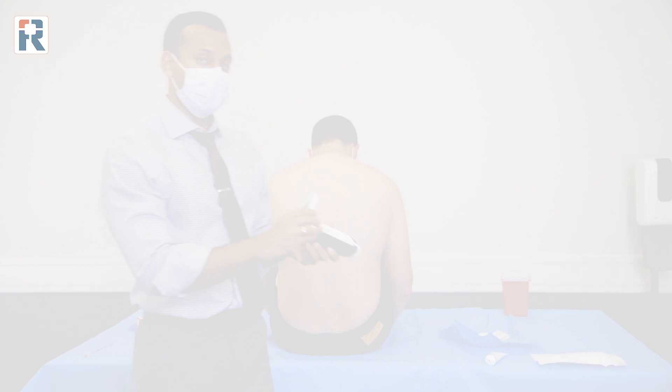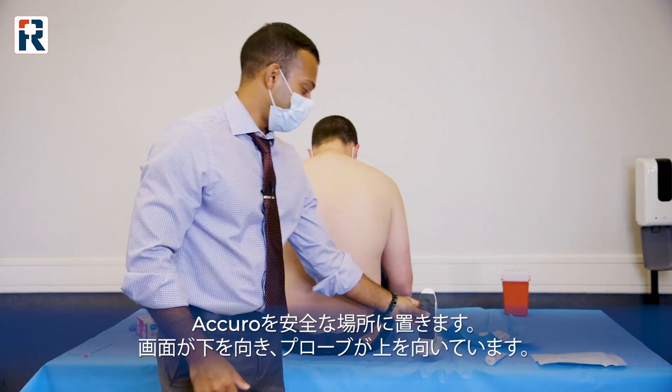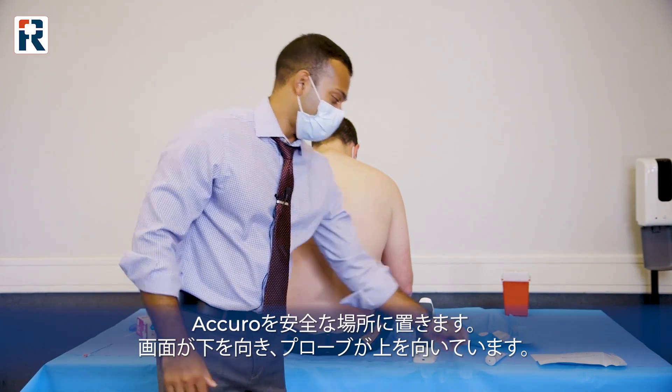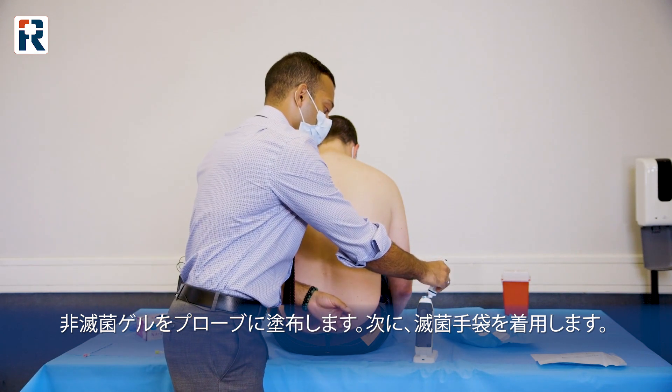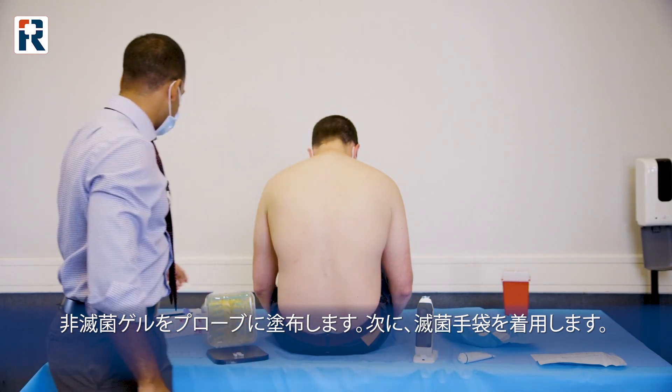You're going to take your device, place the screen facing down, and have the back end pointing up. You're going to put your non-sterile gel on top of this, and then you're going to put on your sterile gloves.